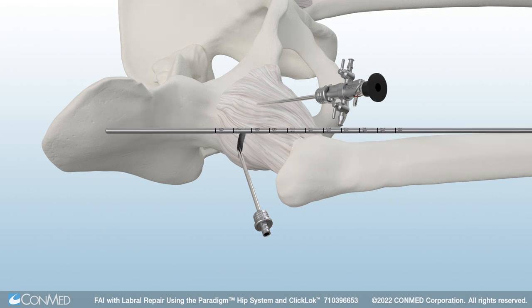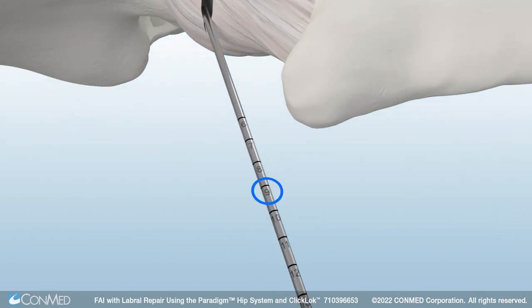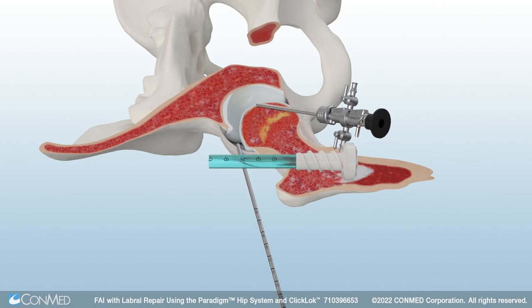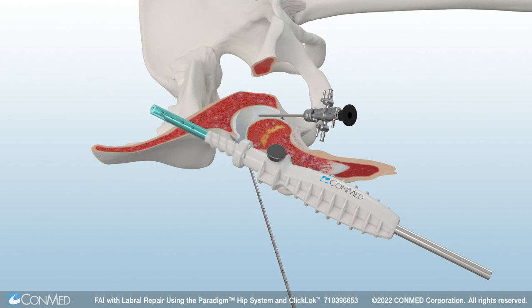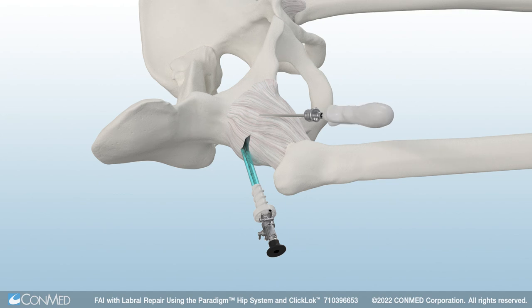The first Paradigm Easy Switch Portal Saver can be introduced. Use the reference tool to find the appropriate length for the Easy Switch, then simply cut the Easy Switch to match the patient's anatomy. Insertion is simple: load the Easy Switch onto the obturator, then adjust the obturator to accommodate the custom length of the Easy Switch. The black laser line should match the distal extent of the Easy Switch. Insert the Easy Switch and obturator over the reference tool, then remove the obturator and reference tool. Repeat this process through the mid-anterior portal to complete the capsulotomy and insert a second Easy Switch.